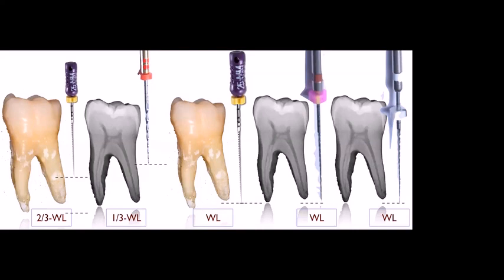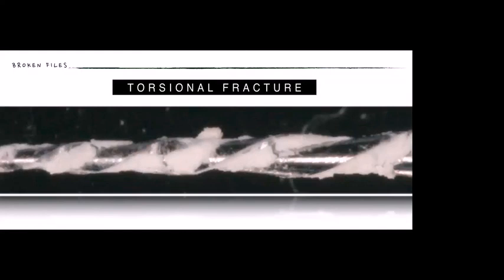And when the 10K file is super loose in the root canal, at that moment I start with the path files. The first path file that I'm using now is the 13 of the M3 Safe path files. So we introduce this file inside the root canal with a low torque. I am using 1.6 torque with 300 RPM. If you feel that the file cannot penetrate, cannot go deeper and deeper, it probably means that there is detritus in the flutes.